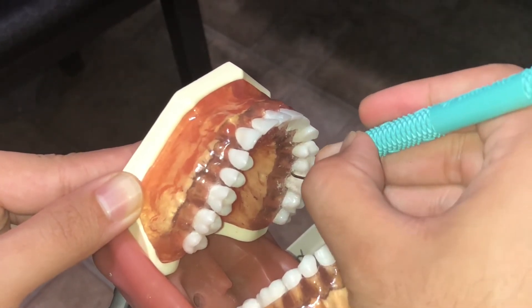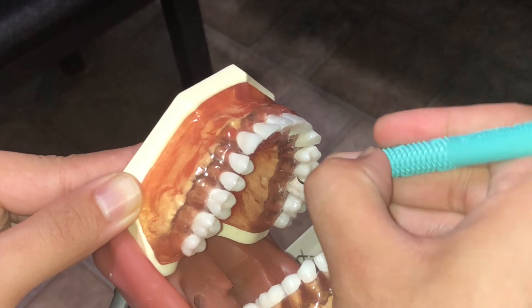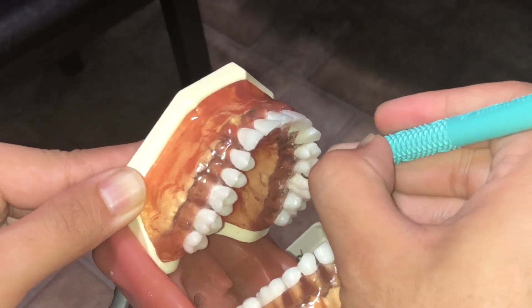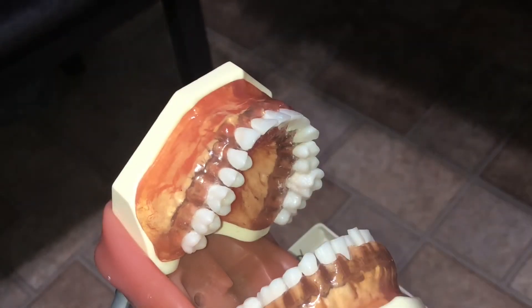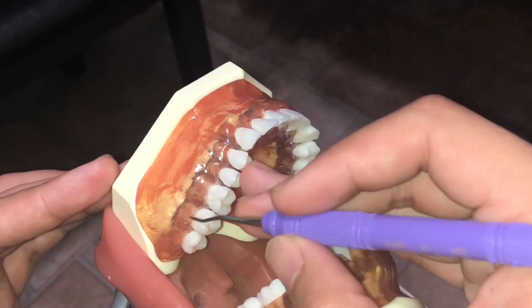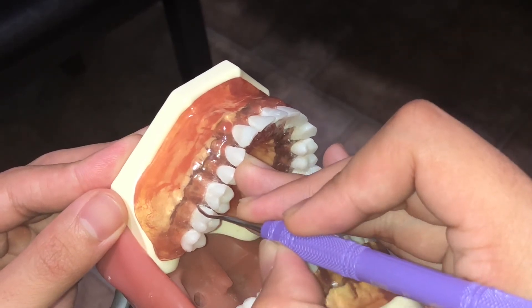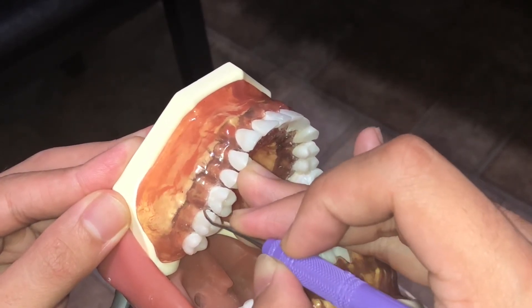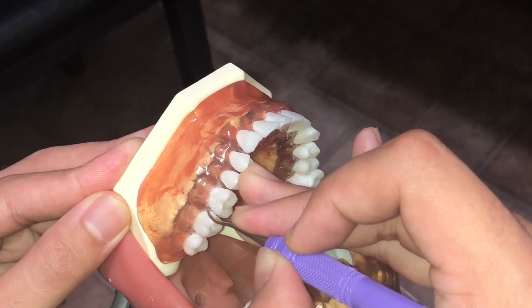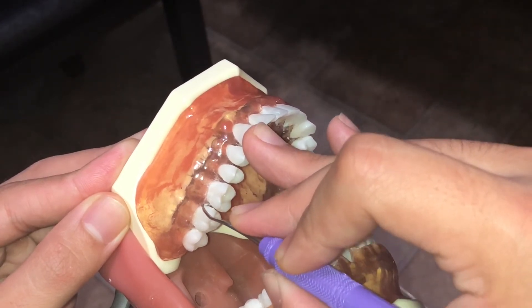Reinsert, open the blade, and activate. Next, I'll be instrumenting number two mesial buccal using a Gracey 11-12. First, I'll establish a fulcrum, then insert my blade, open it, and activate. Then reinsert, open the blade, and activate.